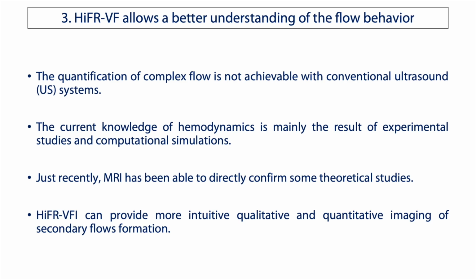Before talking about the third key point, a few considerations are necessary. Conventional ultrasound doesn't allow the quantification of complex flow. Our current knowledge is more theoretical and still lacks sufficient practical support. And high frame rate vector flow is more efficient in providing qualitative and quantitative information.